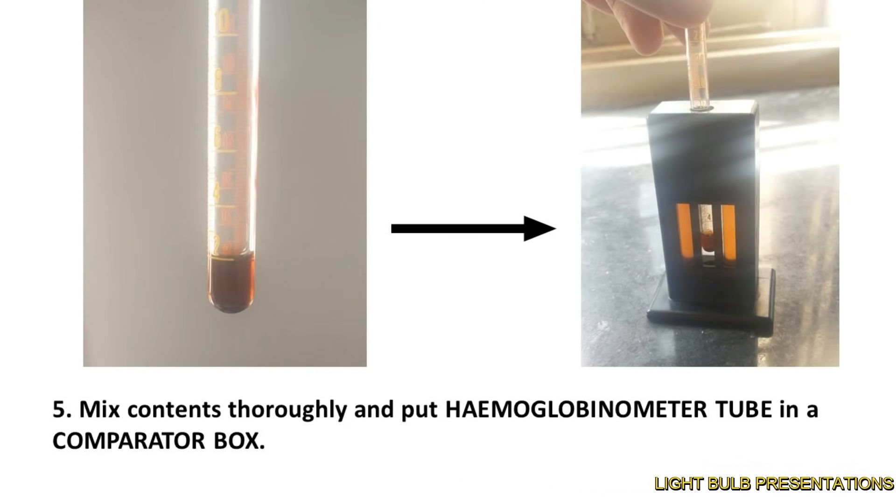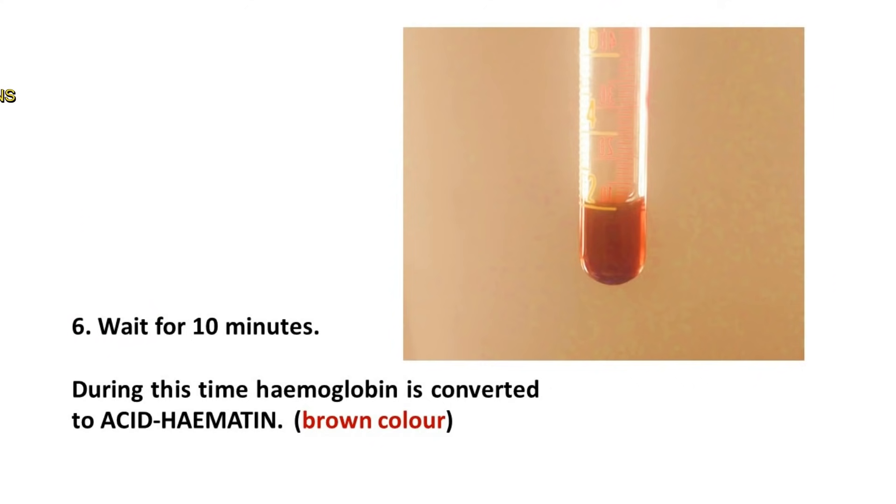Mix the contents thoroughly and put the hemoglobinometer tube in the comparator box. Wait for 10 minutes. During this time, hemoglobin is converted to acid hematin, which looks brown in color. If less than the required amount of HCl is taken, it may not be enough to convert all the hemoglobin present in 20 microlitres of blood to acid hematin, hence giving a lower value for hemoglobin.